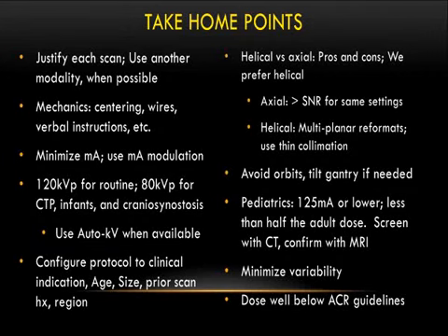Okay, do we have any questions? So I'm kind of hearing from a couple different places that we can maybe use a higher percent of ASiR in the head than in other regions. Is that something you would agree to?